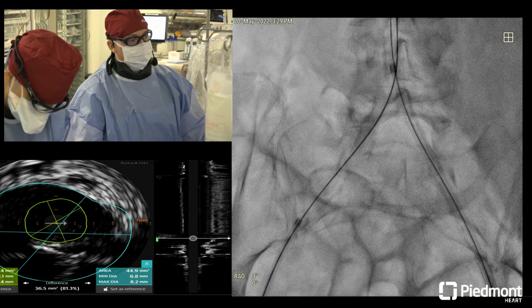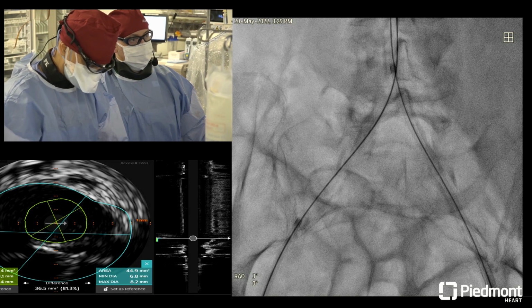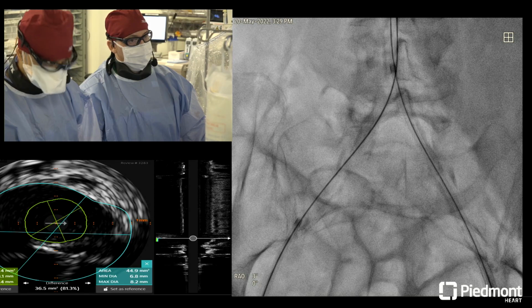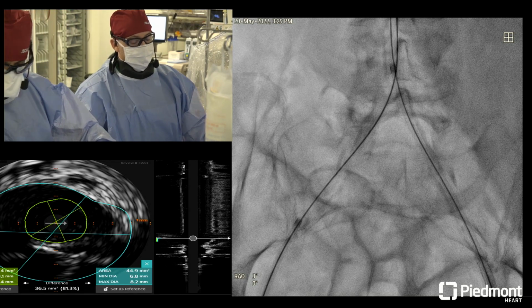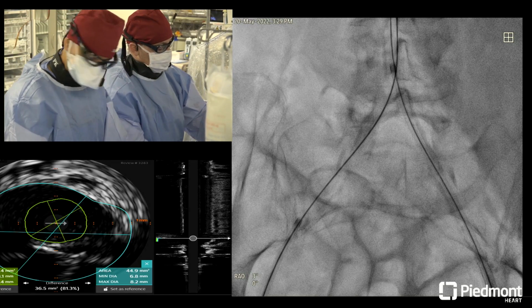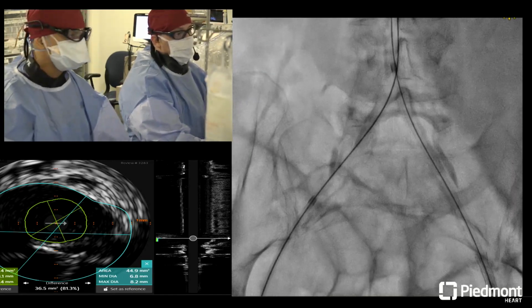So we're going to advance this sheath up so we don't have any issues in tracking, but also so we can do a little gradient. I do like to see that. Obviously, it's markedly hypertensive right now. Right now, I'd rather have hypertension than hypo. Distally, and the proximal stuff will just heal itself because it's a retrograde dissection that was created by the.